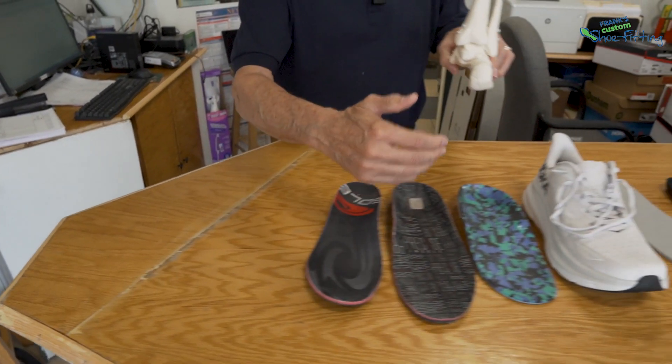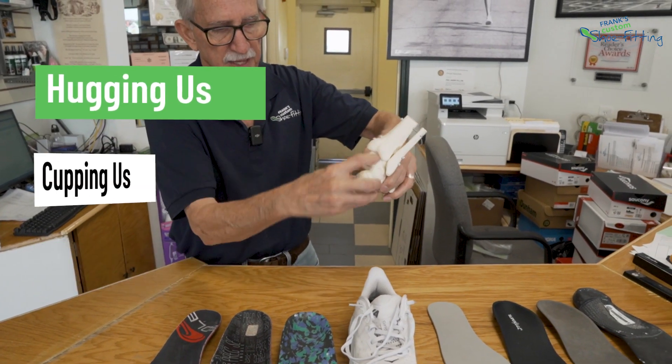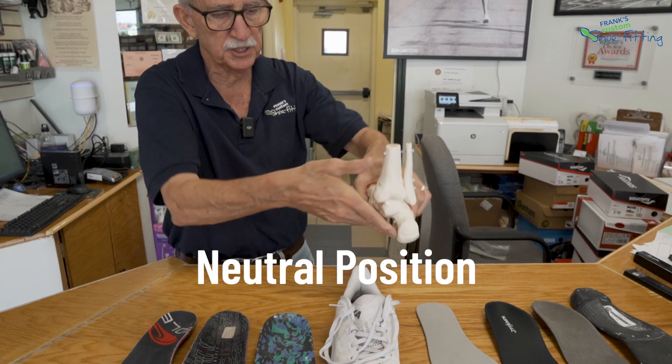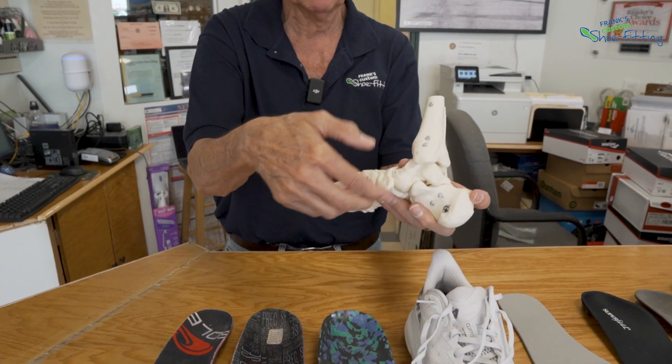We want to make sure the orthotic and the shoe are hugging us, cupping us, supporting us with that big joint and that big joint in what we call the neutral position. We want to make sure that we're supported right up to that bony knob under the inside of our foot called the navicular. So we want to make sure the shoe is doing its best job to help our foot be supported.